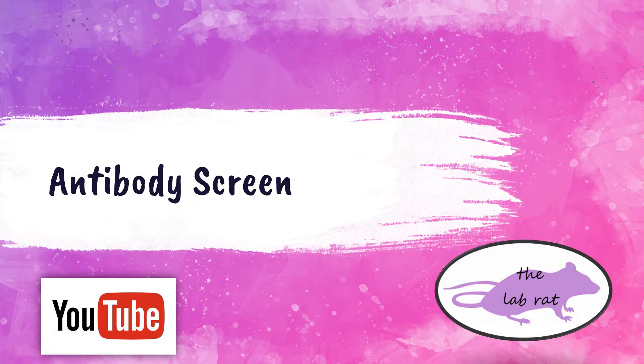Hey Lab Rats, this is Rebecca from the Lab Rat YouTube channel. In this video I am going to be performing an antibody screen. Let's get started.